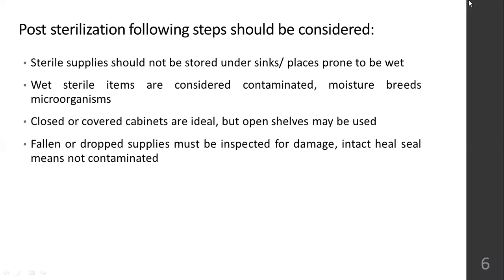Then post-sterilization, the following steps should be considered. Sterile supplies should not be stored under sinks or places that are prone to be wet, okay, that may get wet. Always keep the articles in areas where they will be dry, away from the moisture.